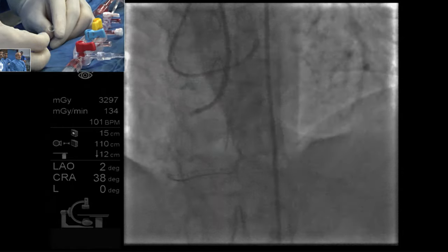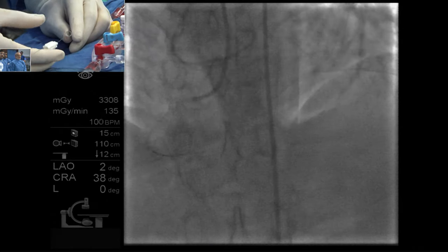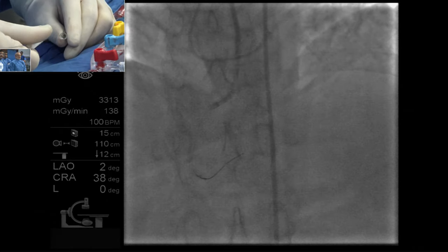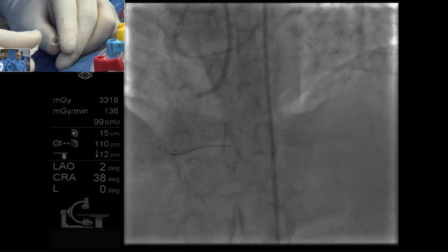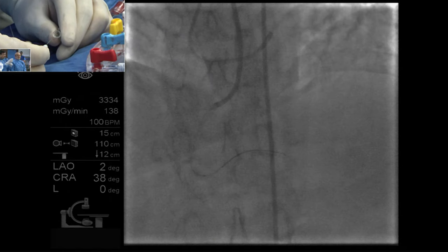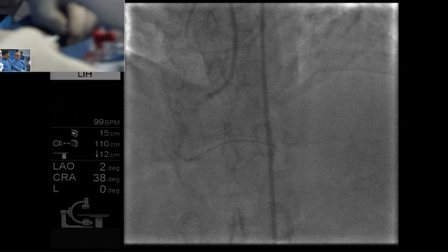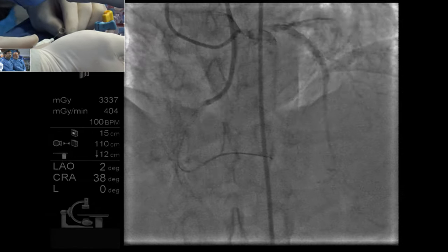Why don't you go to the PLV branch, a small branch first, and see if we can balloon and then go back to PDA later. You think so? Yes. Now, is it the same? Same, sir. Just see. Okay.